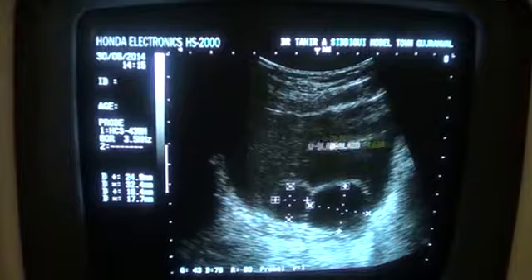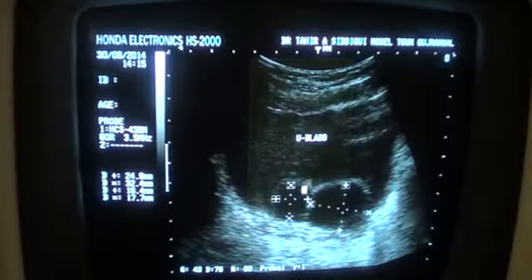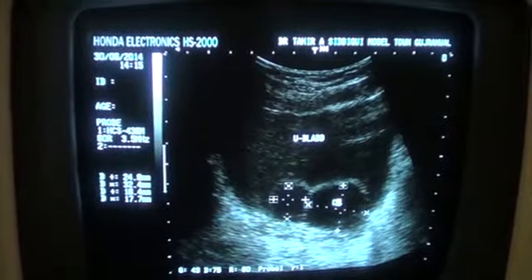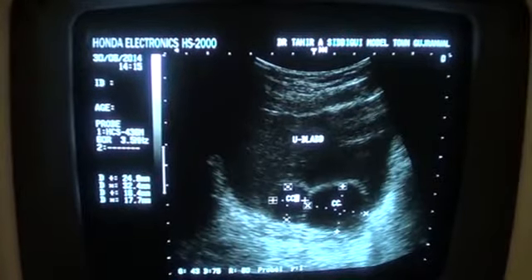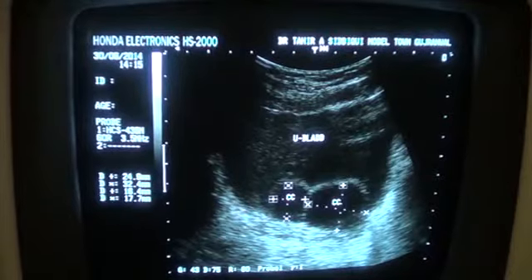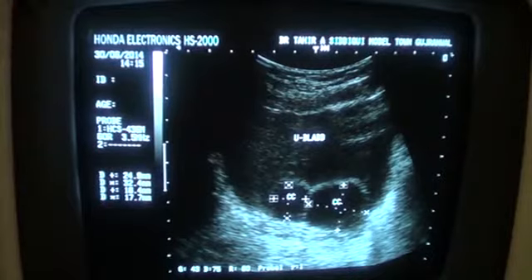And this is the urinary bladder, and this cystic area is a part of this cystic area, and this is in fact dilated, and it is the ureterocele that we are seeing, or the dilated ureter in this region.